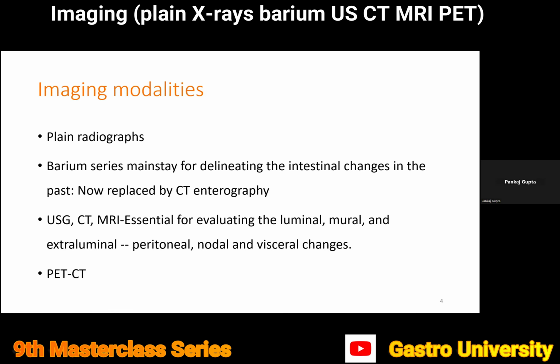Coming to the various imaging modalities, we have a host of investigations available, of which plain radiographs are the basic initial investigation we rely on. The barium series, including barium meal and barium meal follow-through, was considered a very important imaging component for evaluating patients with suspected GI tuberculosis, but it has mostly been replaced by CT-based studies, including CT enterography. I will be talking about that later.